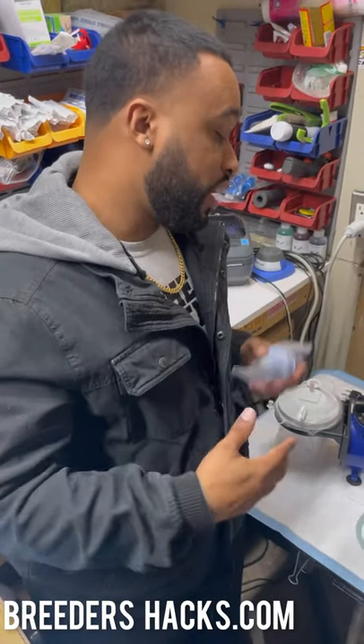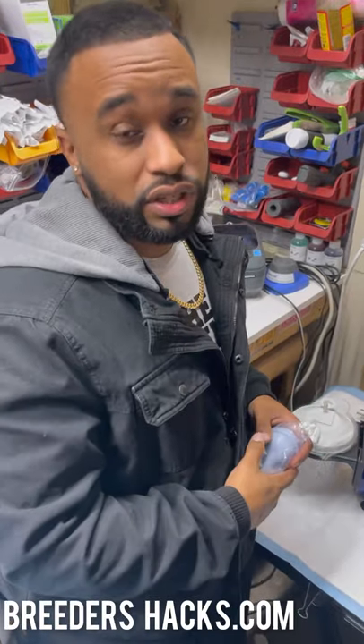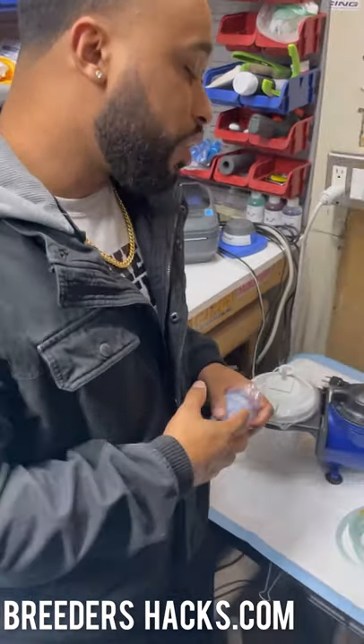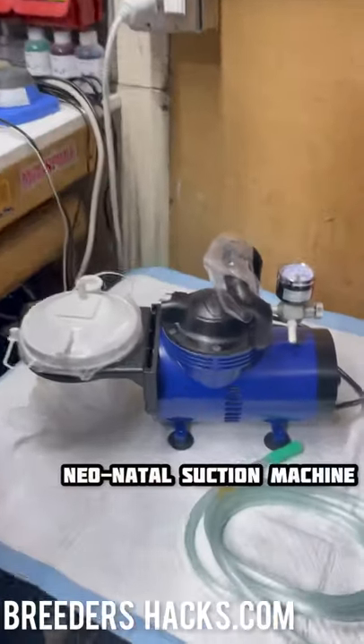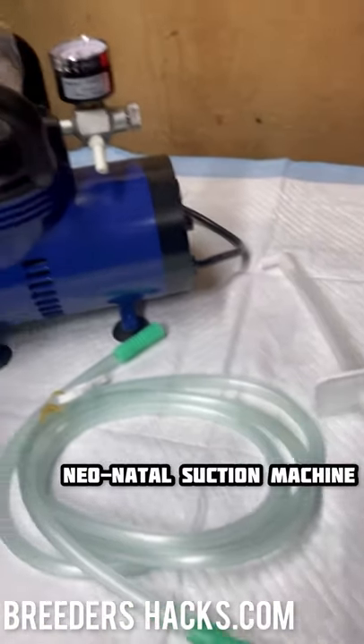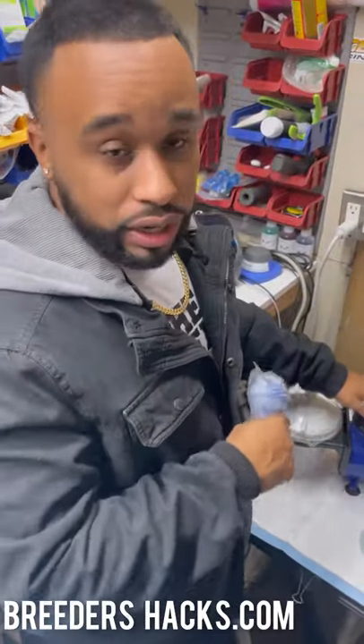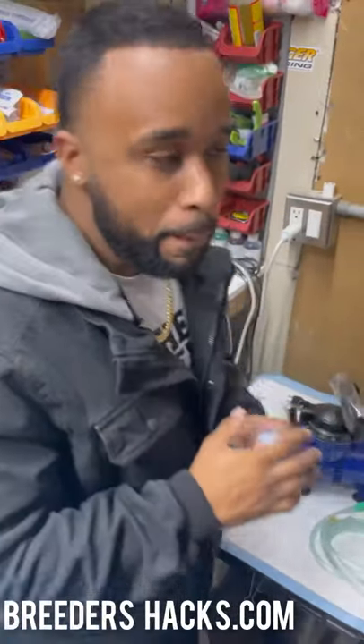Welcome to another quick episode of Breeders Hacks. Today we're going to talk about a neonatal suction machine. This is something we have on breedershacks.com and it has been a lifesaver — let me explain why.